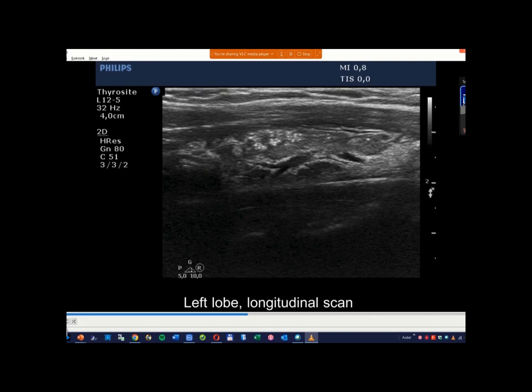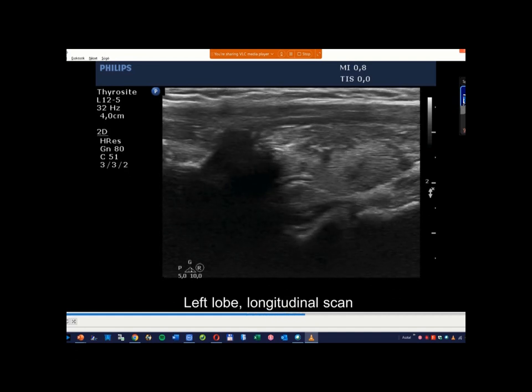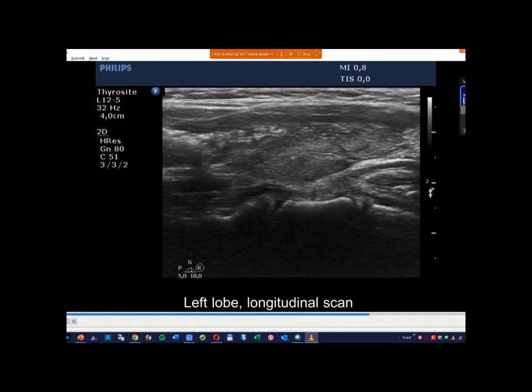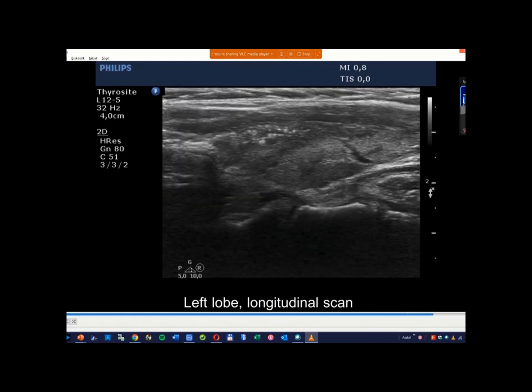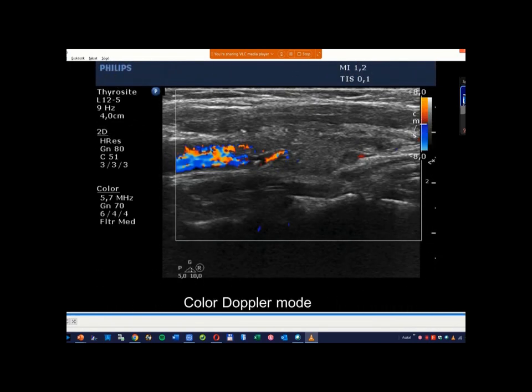And it is also an important sign, which somebody mentioned, that if it is a papillary cancer, it is very close to the ventral border. We cannot exclude the possibility of extrathyroidal extension in such a case if it turns out to be malignant. But it turned out to be benign Hashimoto's thyroiditis. So we have to be modest, we have to take risks, but occasionally we fail.